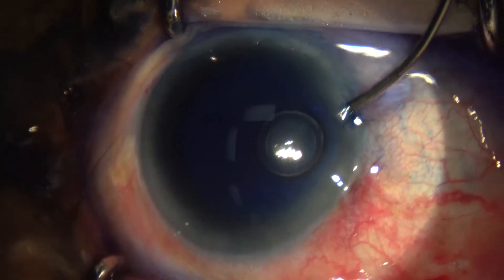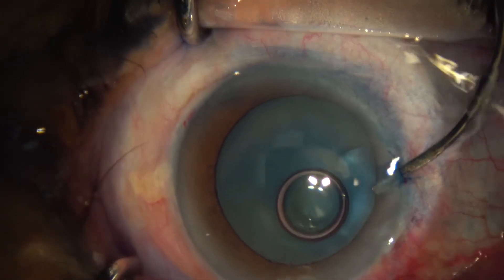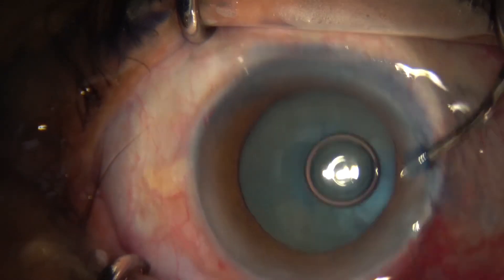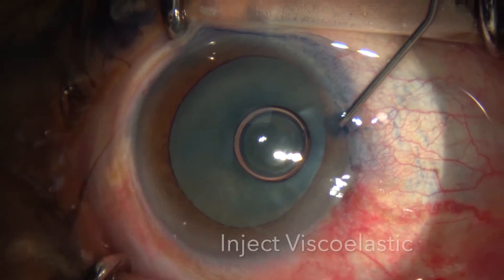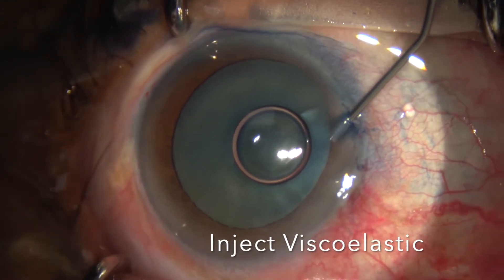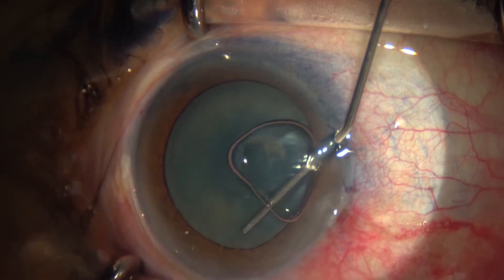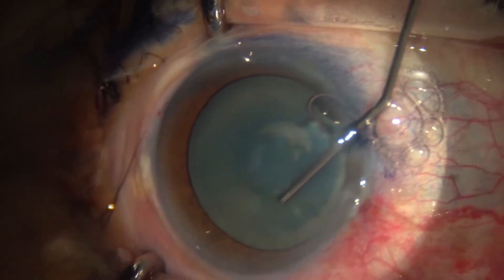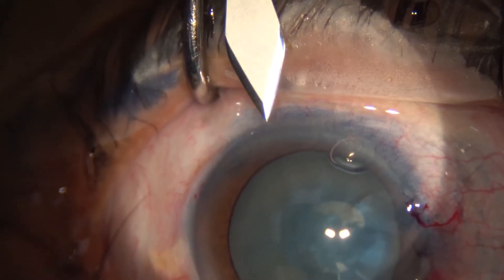We wash out that dye with a BSS solution. The anterior capsule staining makes it easier to see when we go and remove the cataract. Then we inject a high molecular weight viscoelastic — such as Healon 5 — to form the anterior chamber, which flattens the anterior capsule so it's easy to work with.